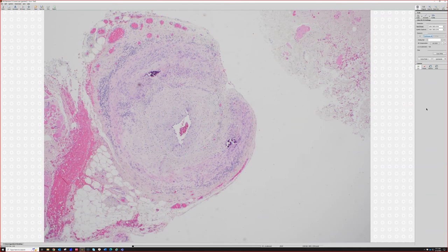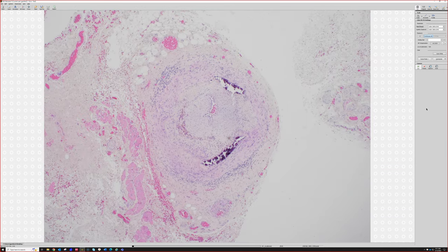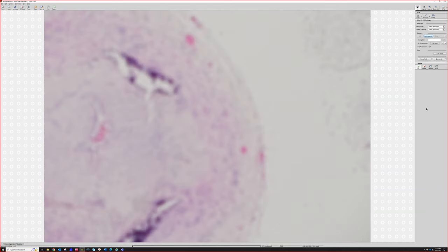That is a common finding in temporal arteries and in other arteries in older adults. When it's in the muscle, you can call that Mönckeberg's medial calcific sclerosis, which is thought to be related with hypertension. And there's debate over whether it helps cause hypertension or is a result of hypertension, chicken or egg. In any case, common finding. Some people split hairs and say, well, if it's just calcification of the internal elastic lamina, which is actually what we see here, that maybe that doesn't represent true Mönckeberg's. Who cares? It's benign incidental calcification, which is just something we see a lot.